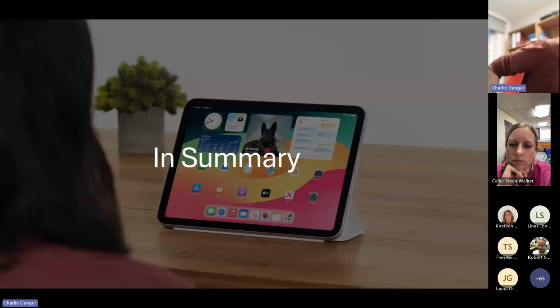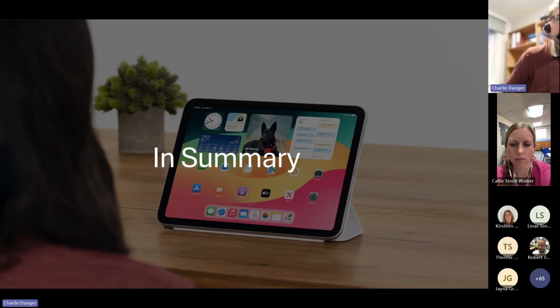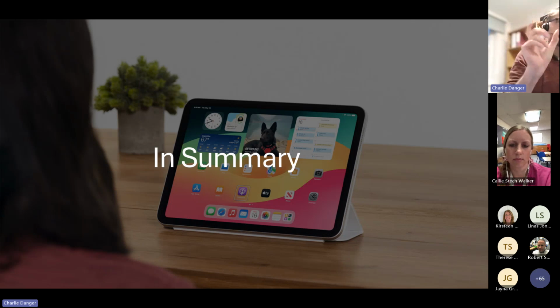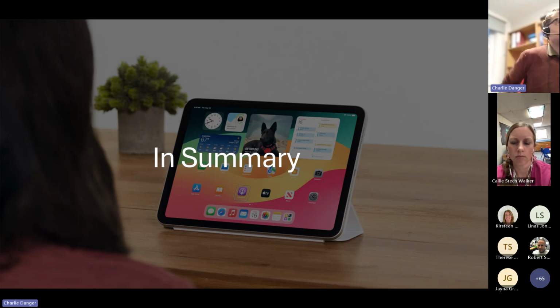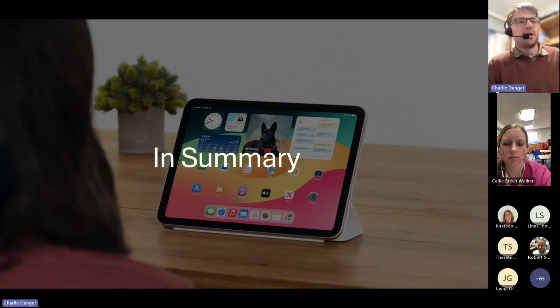Okay, so that's it. That's my experience. I would say that the Apple eye gaze is accurate enough to use on certain vocabularies, and Angela Murad has also found this by looking at one of the vocabularies that uses larger objects. So something like VocoChat or TD Snap with very big buttons, or the aphasia one could work.